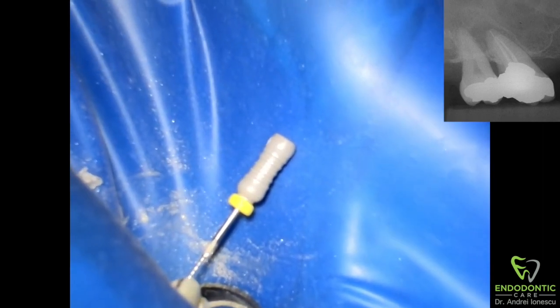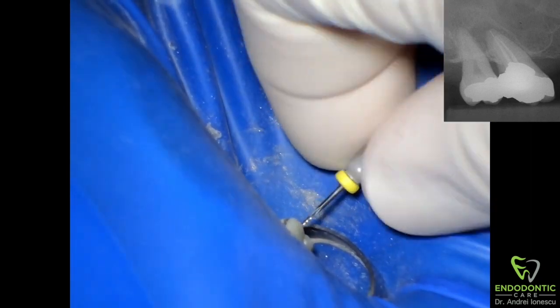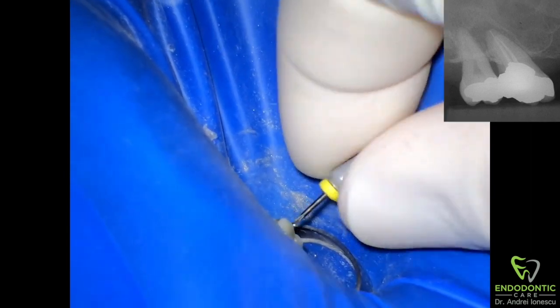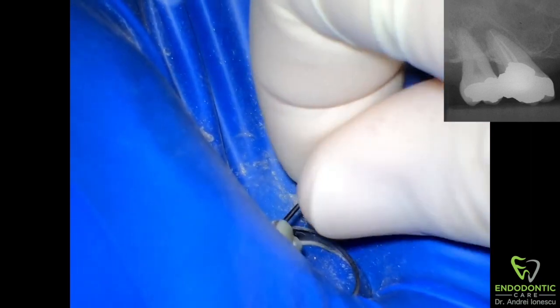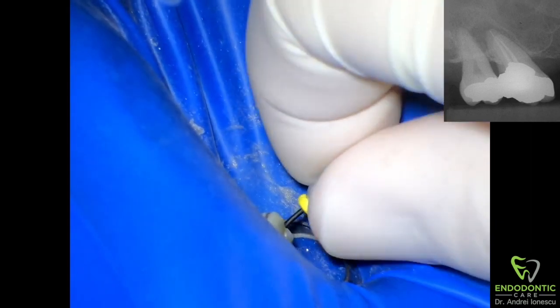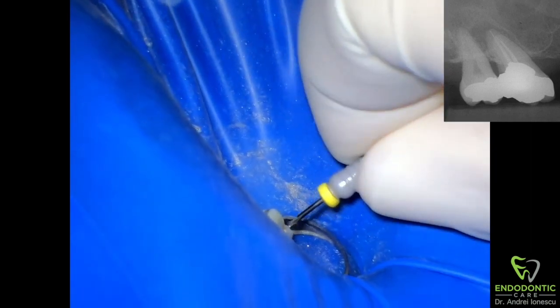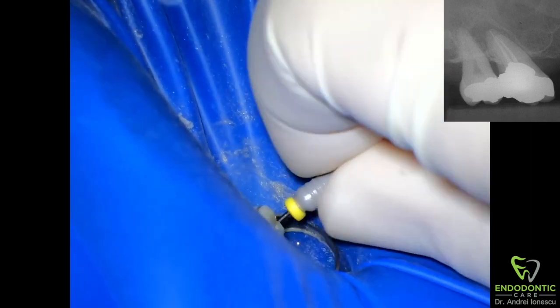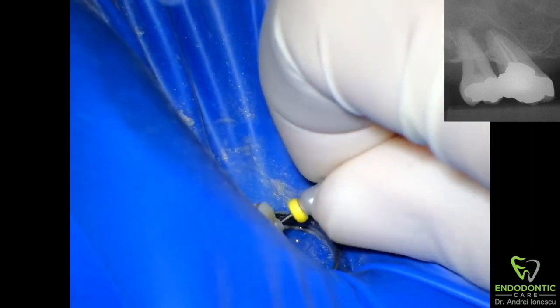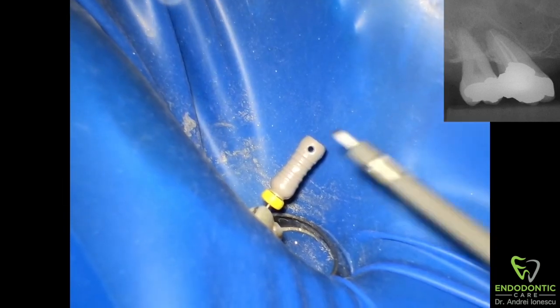Then using a hand file I'm just going to try to work my way alongside these thermofill carriers. Sometimes this is easy — like in this case we get lucky, the palatal canal is a little bit larger so the file passes in quite easily. Other times it's not so easy. If I can't get in with hand files, I'll go straight to a rotary and work my way down, but the key is to have as much chloroform in there as possible so there's always liquid in contact with the rubber.